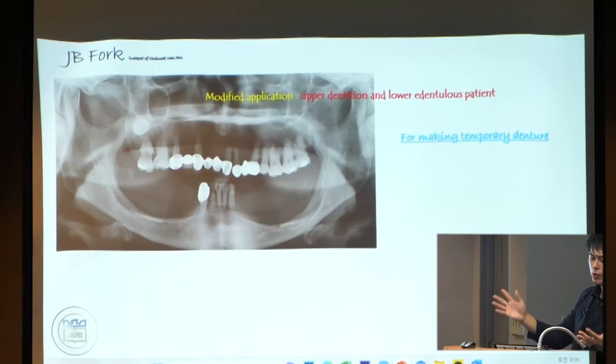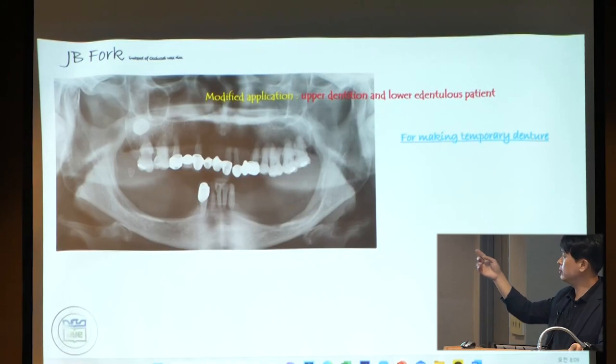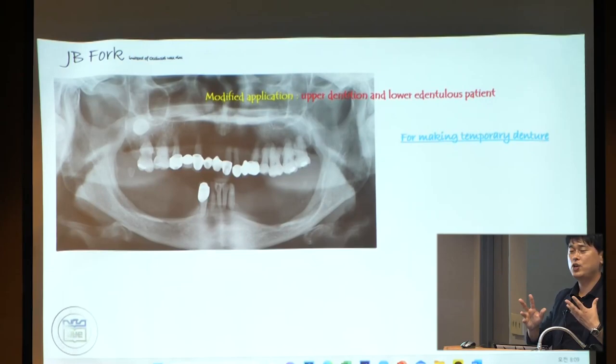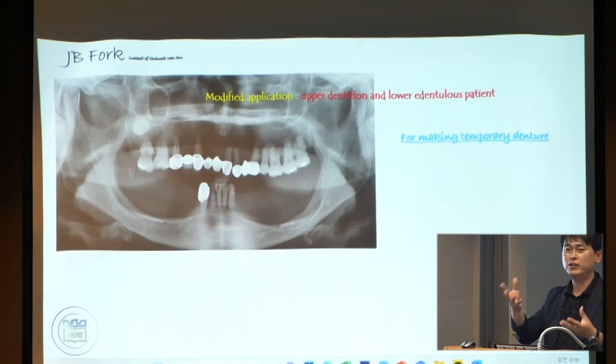I want to show you the modified application. There are several modifications. For example, this patient has all upper teeth and a lower edentulous jaw. Another patient has remaining lower teeth and an upper edentulous jaw. You can modify the JB fork application according to the patient's situation.